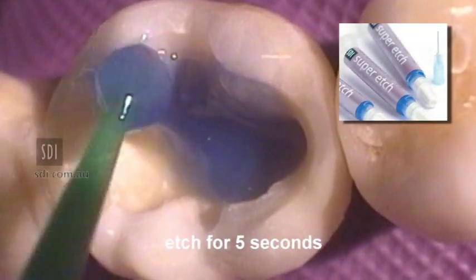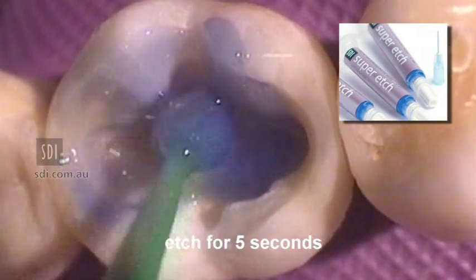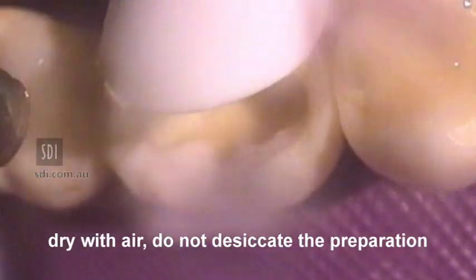Apply Super Etch for 5 seconds. Wash the preparation with copious amounts of water. Remove excess water with air but do not desiccate the preparation.